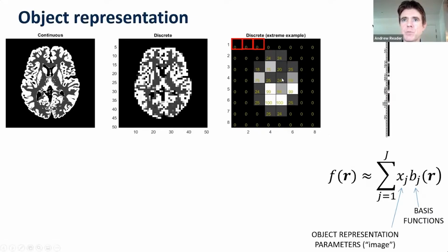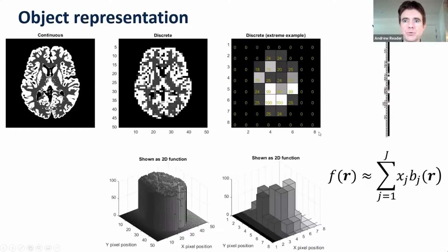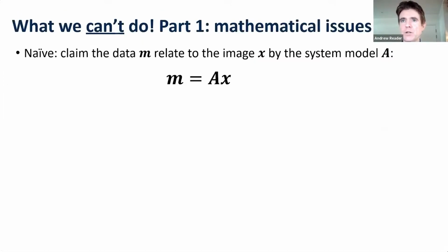And then just to spell out the example there, I'm showing 3 pixels, and showing that, of course, these representations could just be regarded as these top hat pixel or voxel basis functions with particular amplitudes given by those coefficients which are stacked in that vector. So that's just to really make it clear what we're talking about in terms of what we're estimating, especially when it comes to statistical iterative image reconstruction. So basically pixel or voxel values.